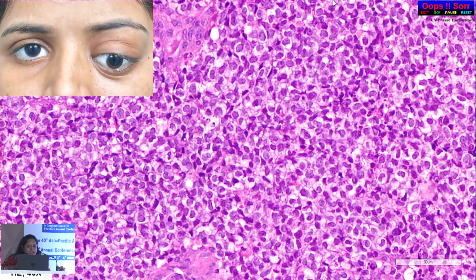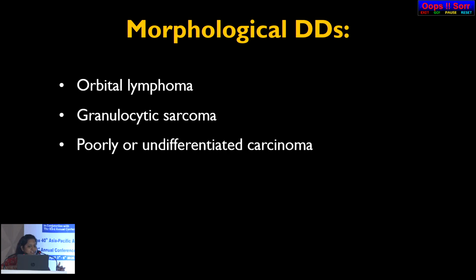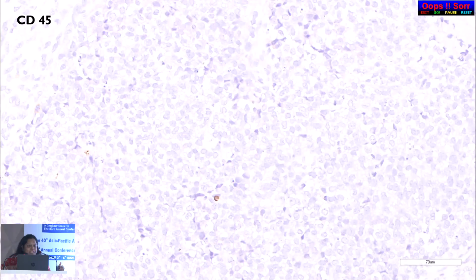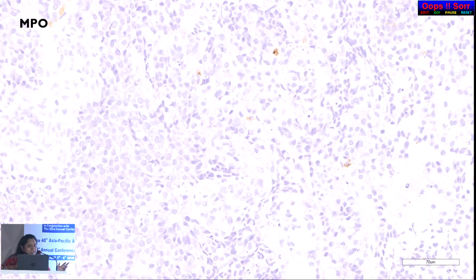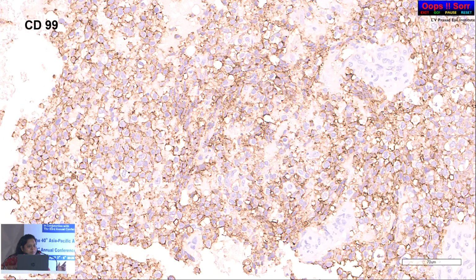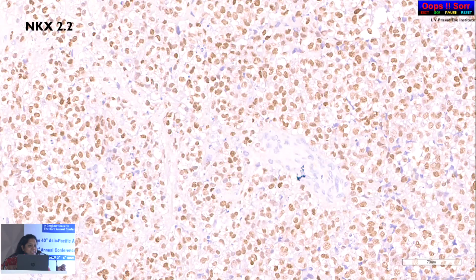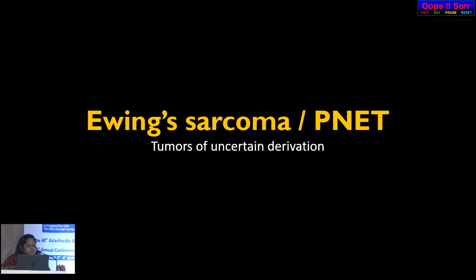Now coming back to our case, the morphological differential diagnoses here were orbital lymphoma, granulocytic sarcoma, poorly or undifferentiated carcinoma, and Ewing's sarcoma/PNET. So we went ahead and did IHC with CD45, which was negative, CD20 was negative, MPO was negative, PanCK was negative, CD99 showed membranous positivity, Ki67 was quite high, and NKX2.2, which is one of the transcription markers for PNET, was positive. This was a case of Ewing's sarcoma/PNET.